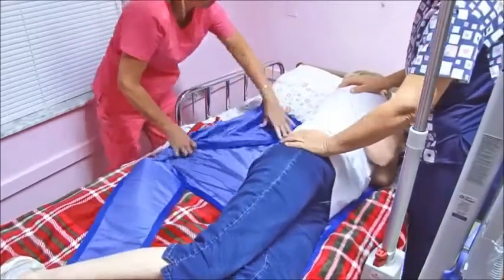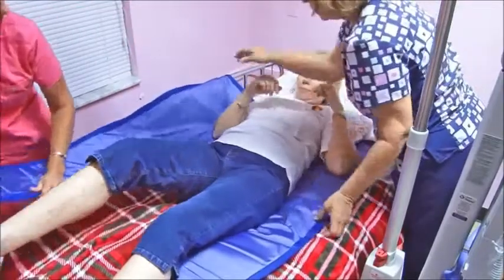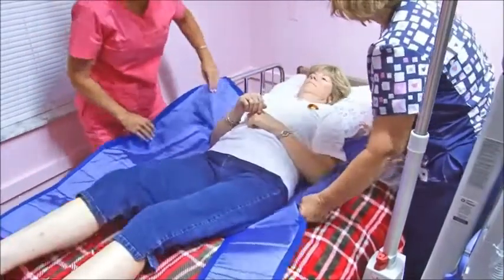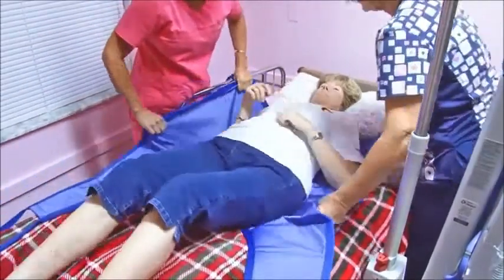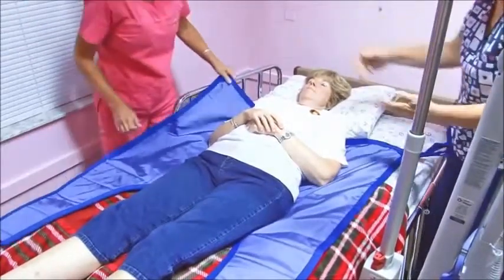Support you while you're that way. Okay. Yeah, there you go. All right. Now the resident is in the center of the sling.